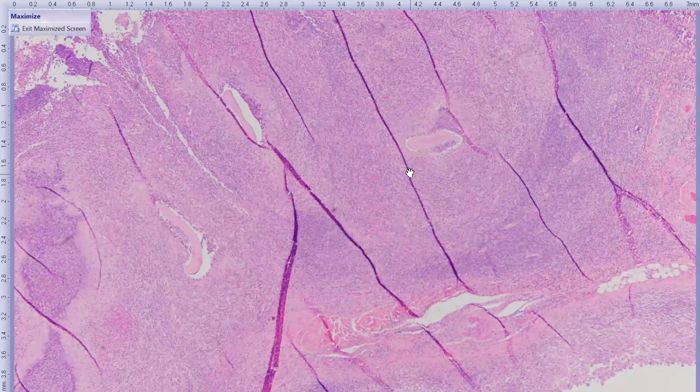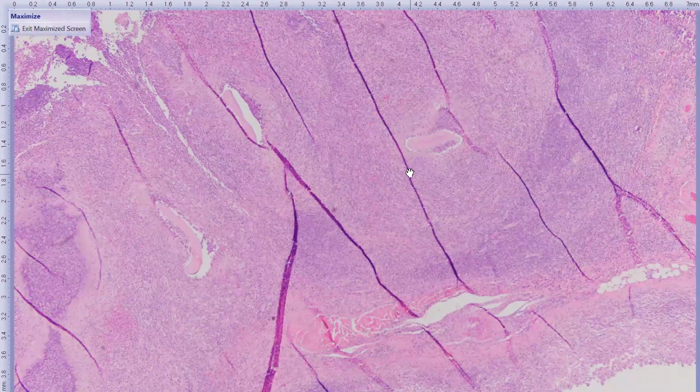And honestly, when I grossed it, I thought, oh, this is going to be a tumor. So when I put the slide on my scope, I'm like, oh, wait a minute, that's not a tumor. So I asked the clinician in my report if this cat had any kind of travel history. And they came back and said that the cat had actually a medical history from a vet clinic in Utah. So apparently this cat had lived in Utah at some point.